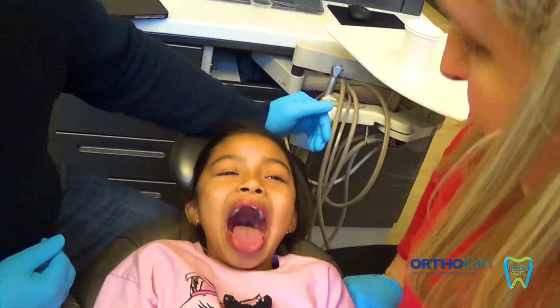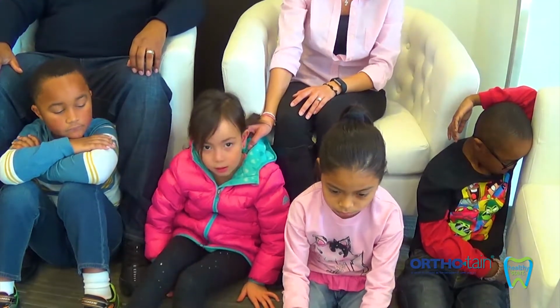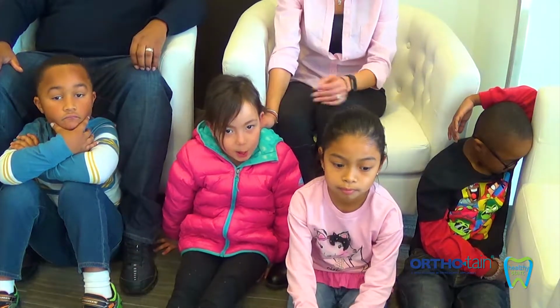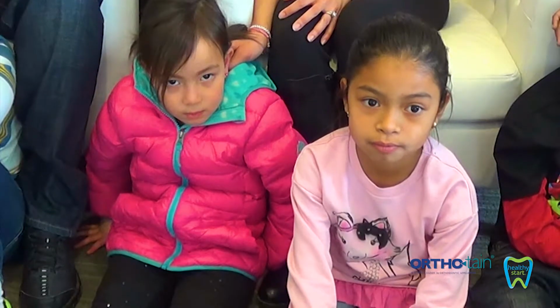Say ah. Vanessa has been my patient for the last probably 3 or 4 years. She presents with a pretty significant open bite. She has been sucking her thumb mainly at night, right honey? At night, but today she said that she would like to stop, but she doesn't know how, so we are hoping that this will help her with it. Are you excited about getting a habit corrector?